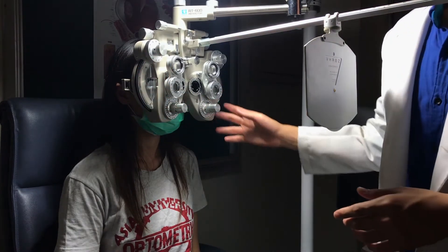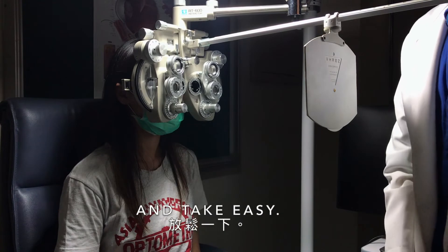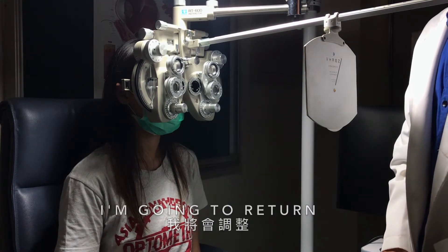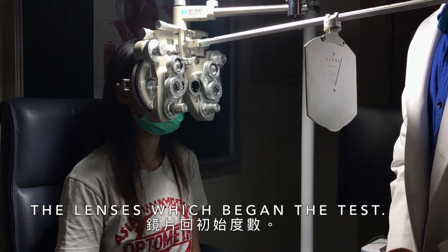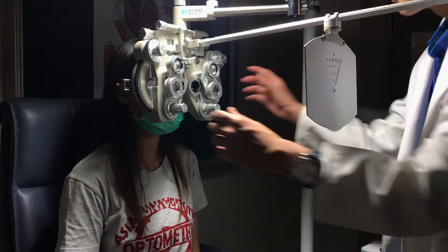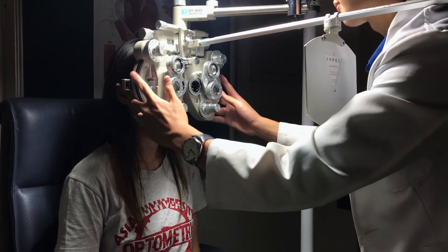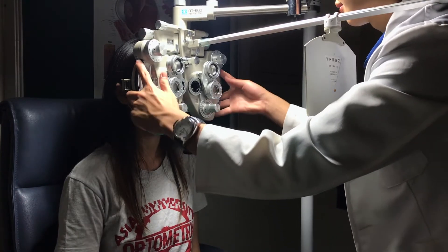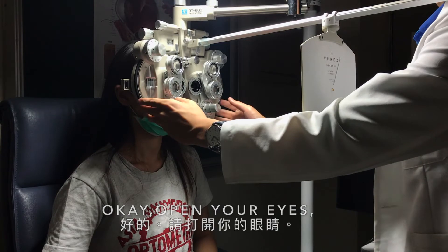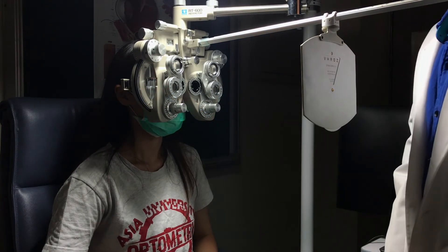Well done. Please close your eyes and take it easy. I am going to return the lens which began the test. Open your eyes. Is the bottom line clear or not? Clear.